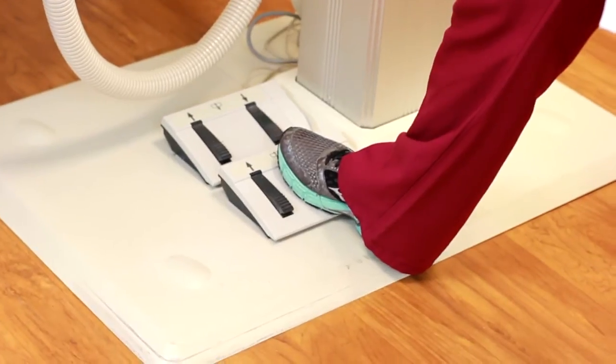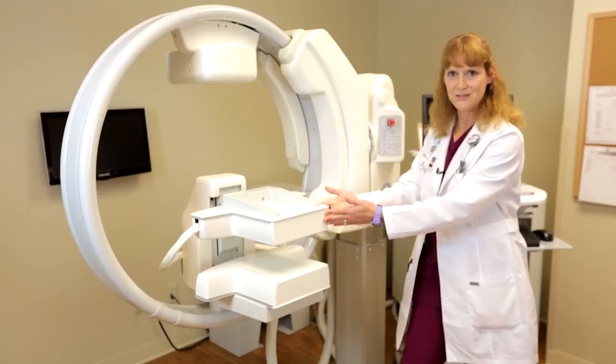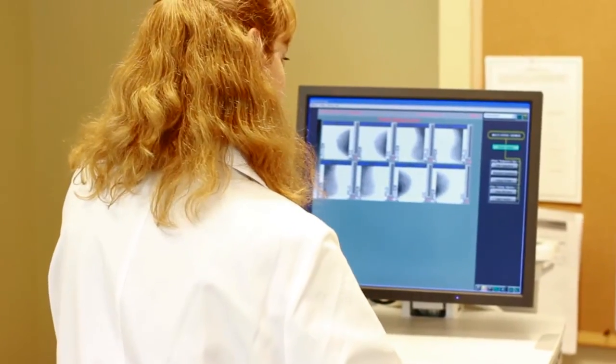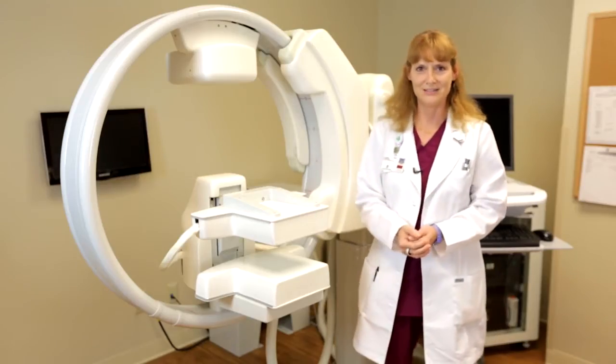We have a foot pedal that allows us to bring the top detector down or up for compression purposes, our workstation to send our images to the radiologist reading station, our chiller and our computer box.